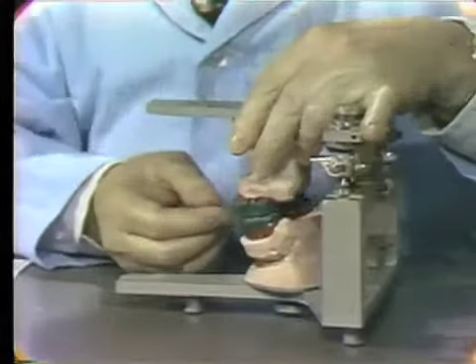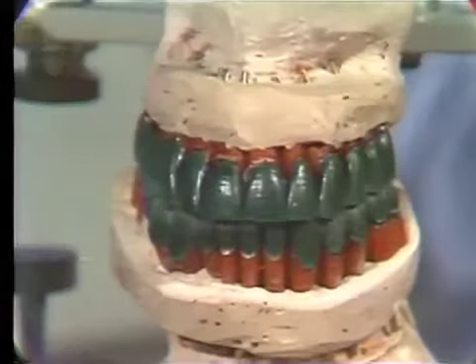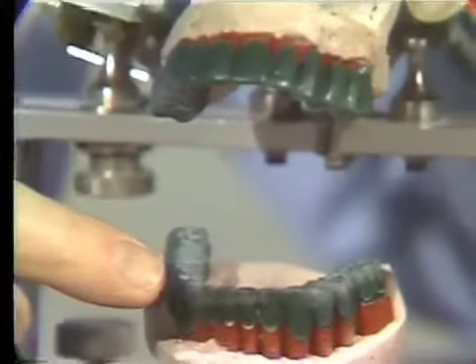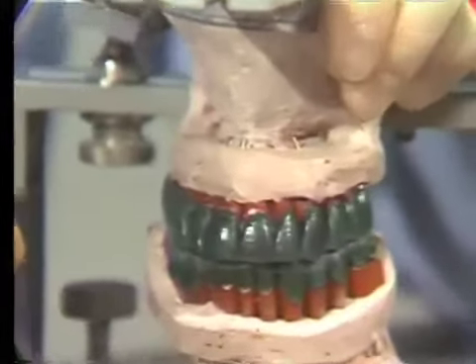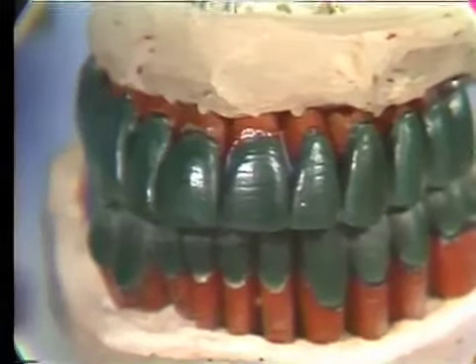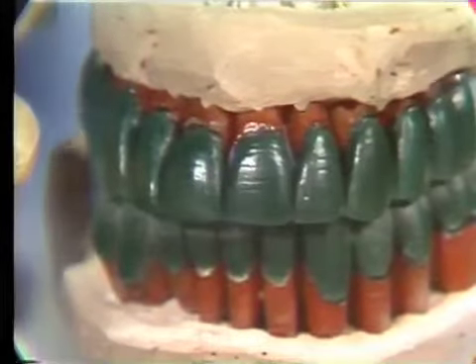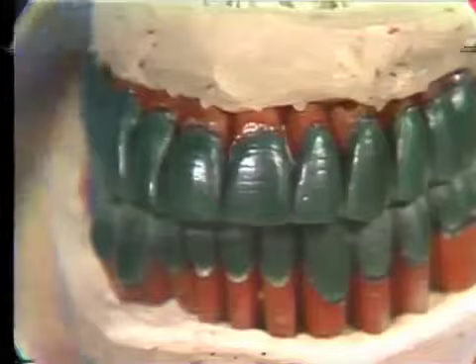Once we've checked the contacts, the guidance, and the margins, we're now ready to send this back to the laboratory for the completion of our anterior teeth. In this instance, I'll go ahead and cast the 6 lower anterior teeth and the 6 maxillary anterior teeth, bake the porcelain. This will give us our anterior guidance, and we'll return the case from the lab and we'll refine the posterior teeth. At this stage of the case, we would send back to the lab instructions about how we would want the design of the porcelain area, and also the shade guide and the shade button that we would like for the teeth.